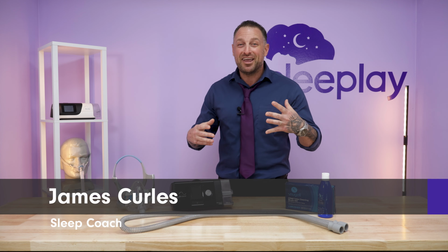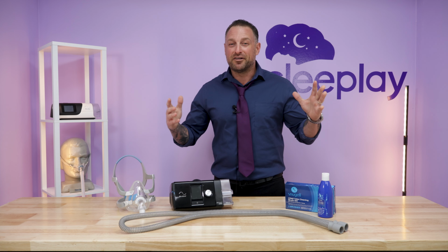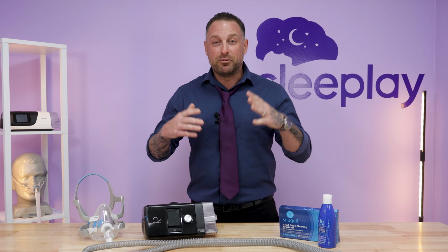I always say routine work makes the clean work, because if you're not doing it routinely, you're going to forget constantly, okay? And people do forget, because I was one of them. And so the water chamber gets yellow, your tubing inside is probably filthy, and it's causing bacteria and mold to build up. People are getting sick, and this is the reason why. So very simply, I'm going to show you today how to clean everything.